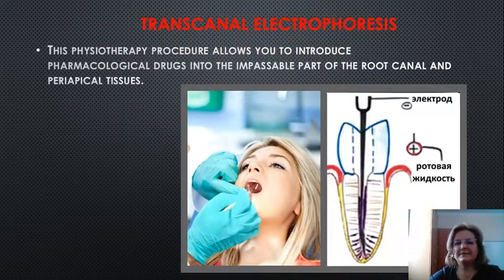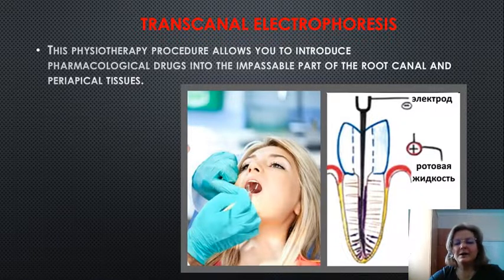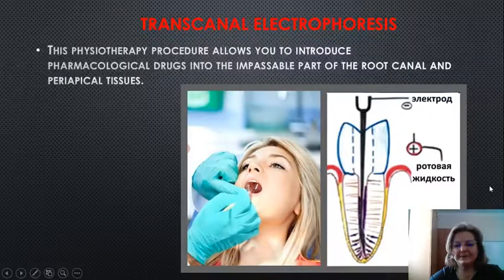The next method, transcanal electrophoresis. This physiotherapy procedure allows you to introduce pharmacological drugs into the impassable part of the root canal and periapical tissues. You see on the picture the scheme of the method.